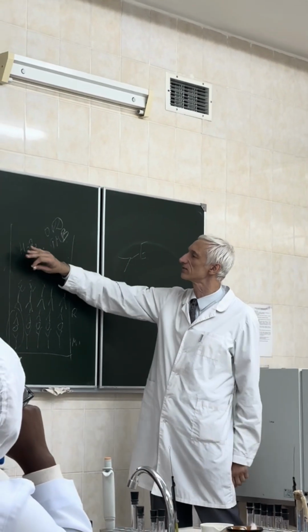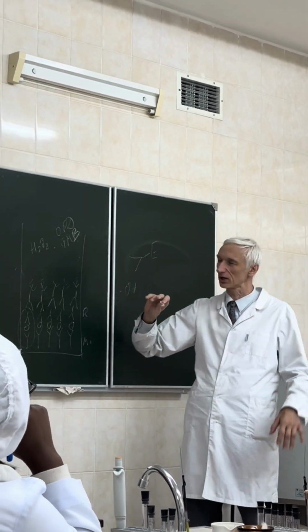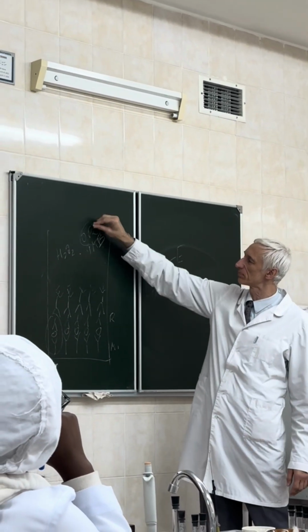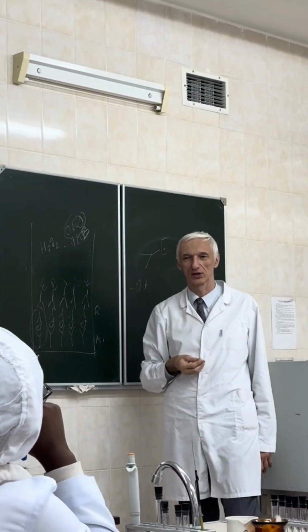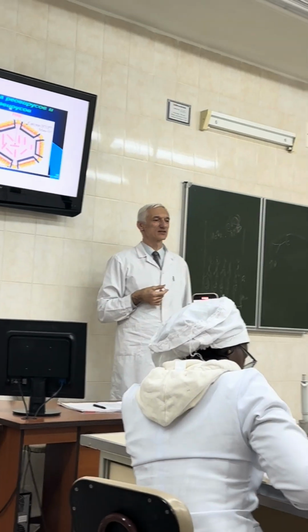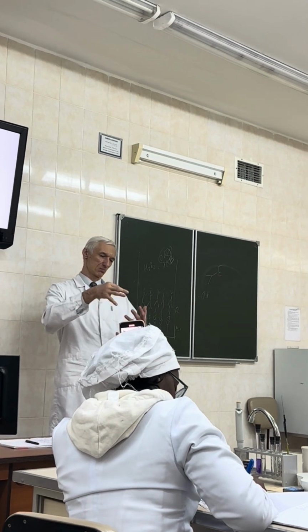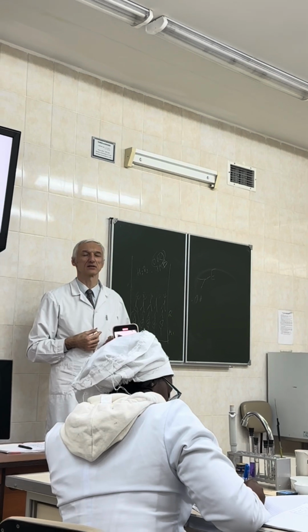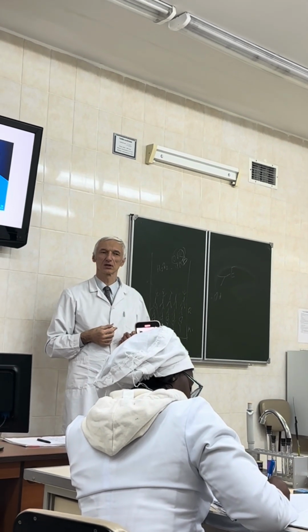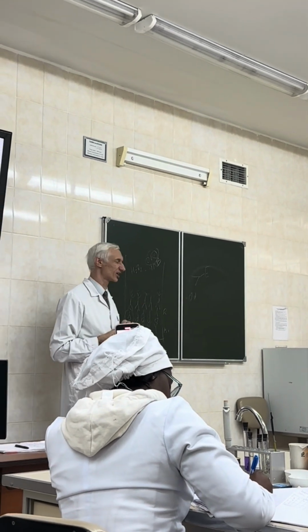And we see a change of color, right? When the reaction is terminated by sulfuric acid, with OPD it will be brown, with TMB it will be yellow, starting from blue and transforming into yellow. Also my standard question: which physical characteristic is the change of color equivalent to? We see color, more or less, colorless. It means optical density. Where do we measure optical density? In a colorimeter, a photoelectric colorimeter, or here it is known as a multi-channel reader.